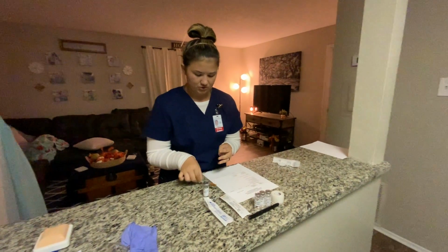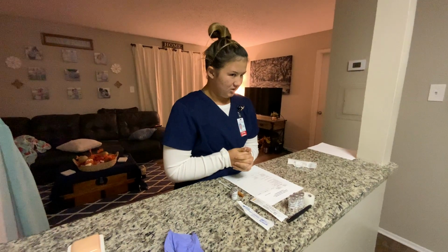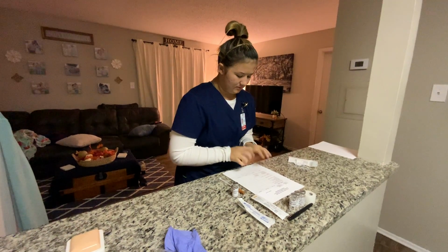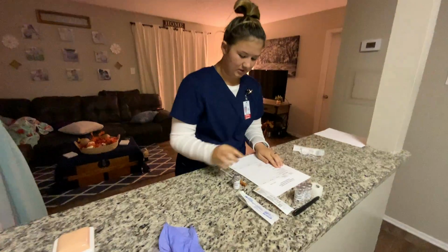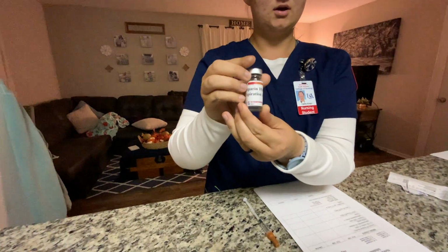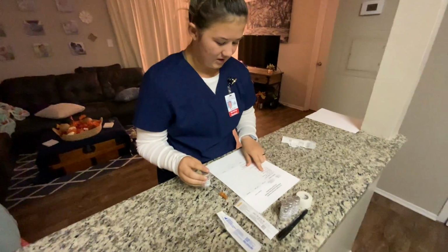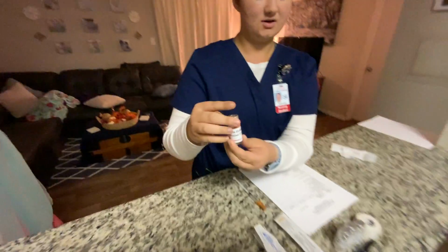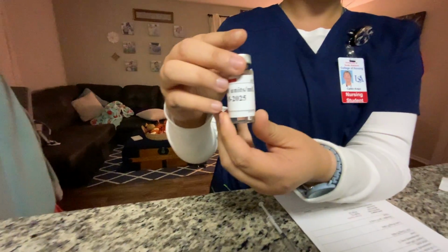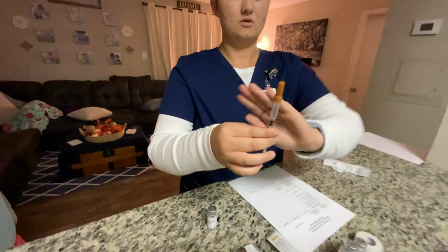So now that I have this drawn up, I am going to do my second check of rights. I'm going to note that the name is Jaguar J. Jones. I'm going to be administering heparin, in which I have heparin. And I'm comparing all this with my MAR. I'm going to be giving 5,000 units, in which it's 10,000 units per milliliter. And I have 0.5 milliliters.